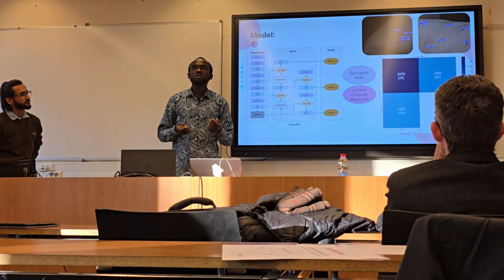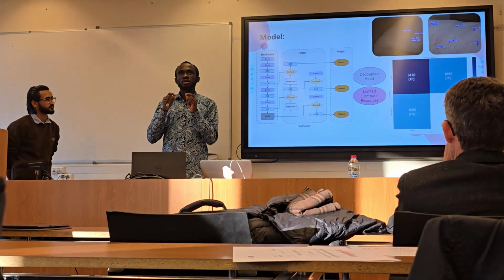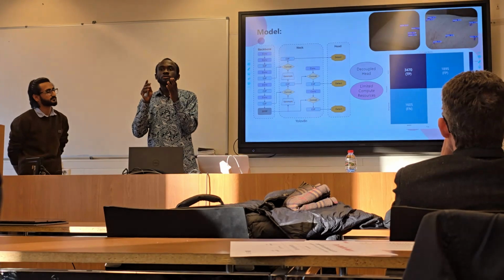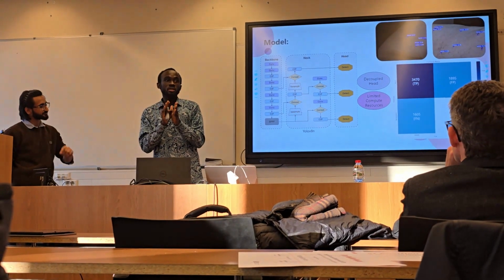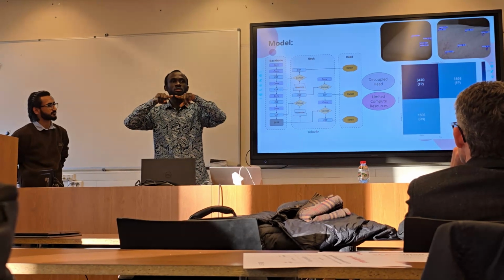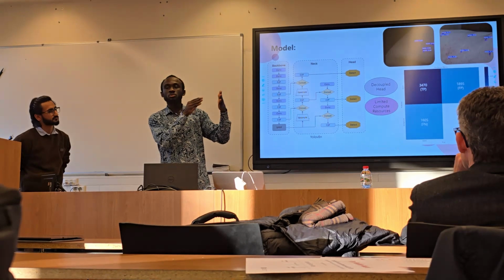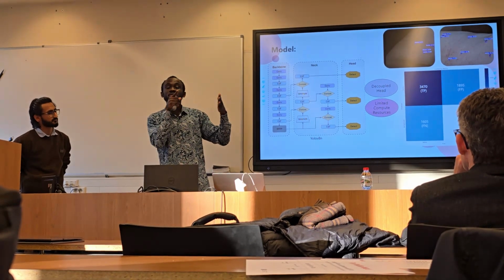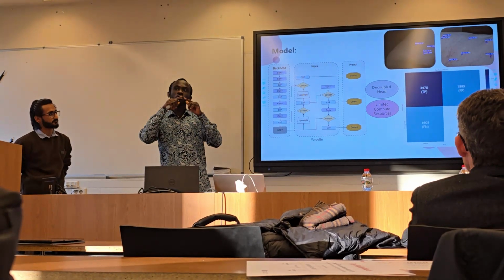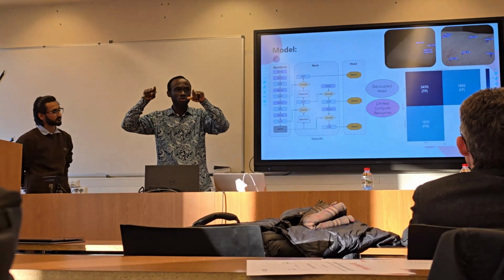Along the line, we noticed that YOLO by default, in the box loss, lays more emphasis on the bounding box. For each of the images, there might be some areas where a lesion might be detected, but based on the fact that we have provided the bounding box, YOLO will just focus on that.